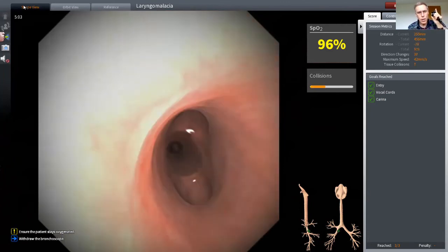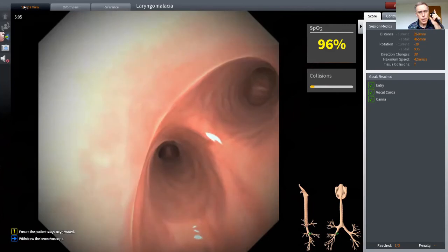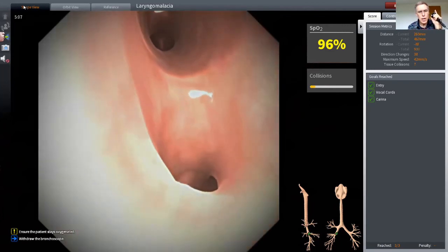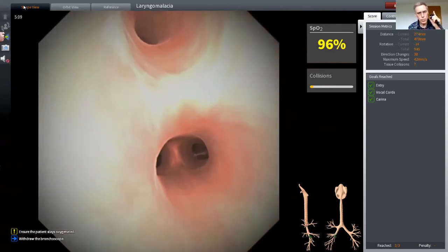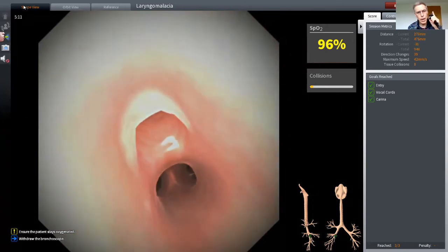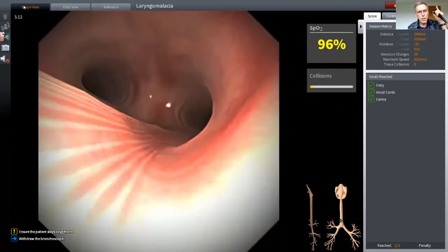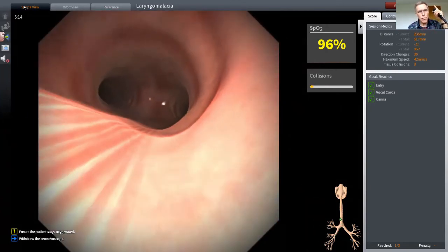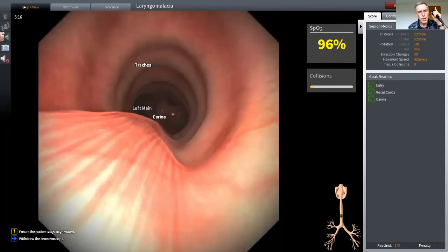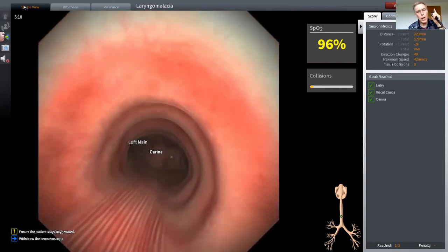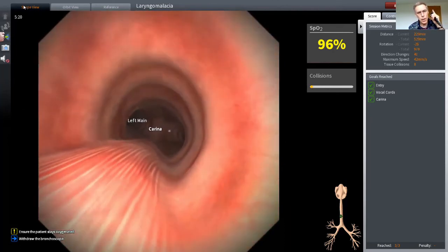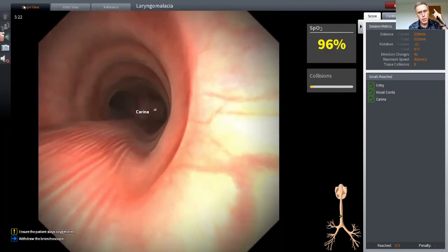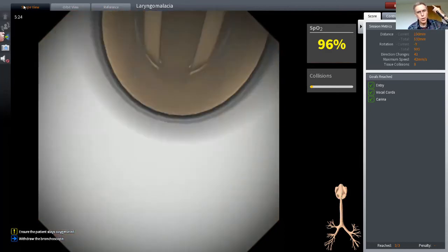Then further down into the distal segment, superior segment, and several other distal segments of the right lung. So that's a very good overview of airway anatomy as well as upper airway. We can do a complete bronchoscopy in this baby if we wish to. So I'm now going to withdraw the bronchoscope.